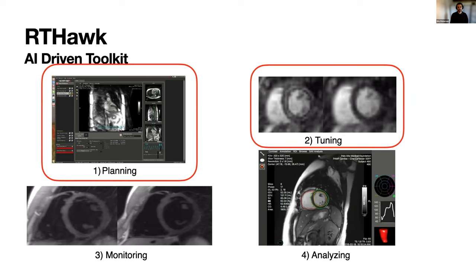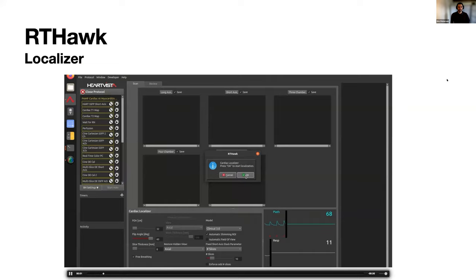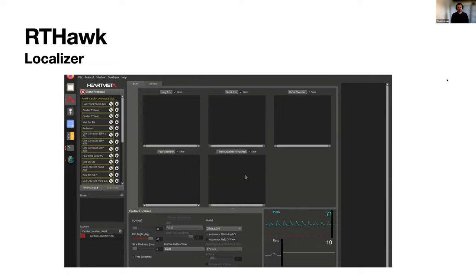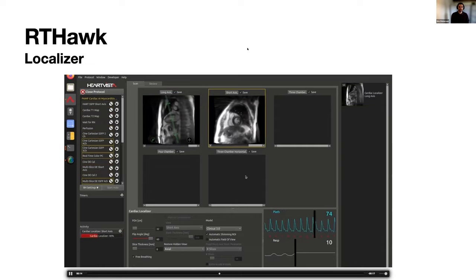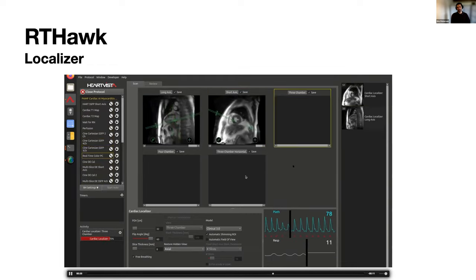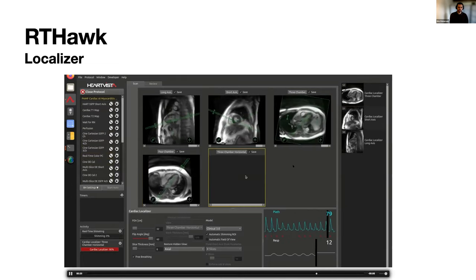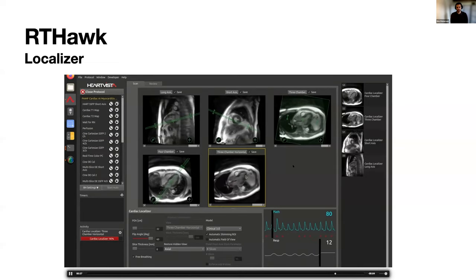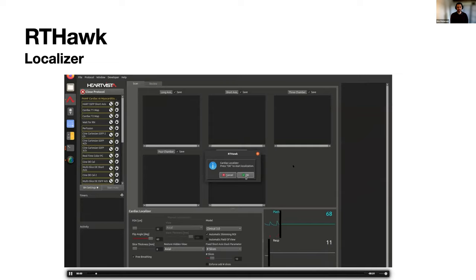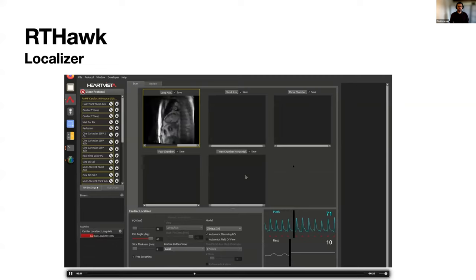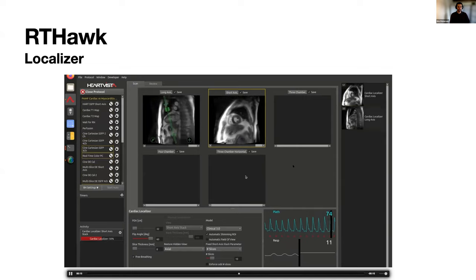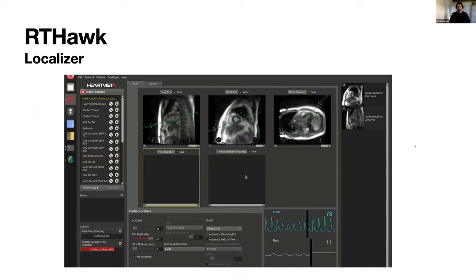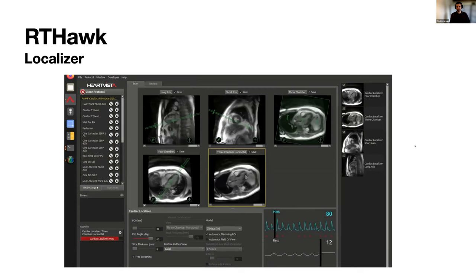Here's what it looks like. You just click go basically and then the localizer finds the heart. It's running, you can see some activity. The images are looking for long axis, short axis, three chamber, four chamber, and the horizontal three chamber views of the heart. This is done automatically in about 20 seconds or so, maybe 30. It finishes—however many views you want. The slow thing here is really the MRI. The AI is quite quick. We just need to acquire enough views for it to know where to go and what to do. That's the basics of the localization and as it's doing this it's doing a lot more which I'll talk about next.